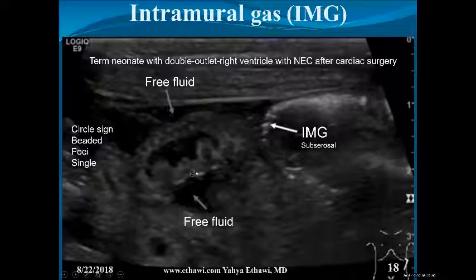It's thickening, I think. A little bit, but it looks healthy to me. Looks like thickening, probably. And there is fluid in here. Yeah. And there is also fluid up and down.